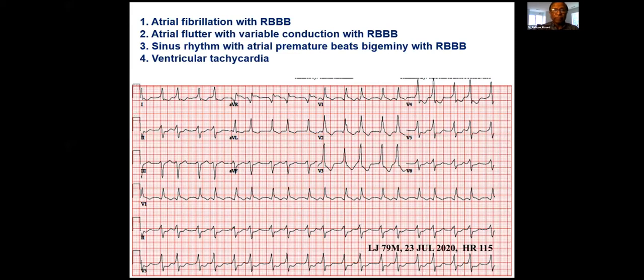This is a very interesting ECG. Sir, the rhythm is clearly irregularly irregular, and we cannot see the P wave. The clean-cut P waves are not visible, and the rhythm is clearly irregular. So my first choice is atrial fibrillation. Number three is clearly out. Then ventricular tachycardia, I think we can also clearly rule out. Then number one and number two. Between these two, I also have atrial fibrillation as first choice because there is no P wave and it is irregularly irregular.